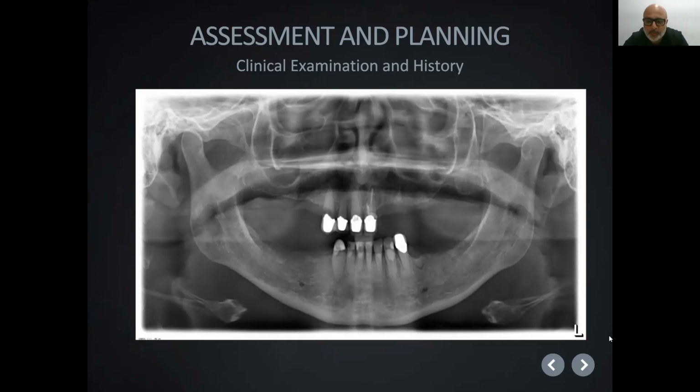Just going through it very quickly, you can see that with the teeth that are there, most of them have a poor prognosis. The lower teeth had a large number of restorations. You've got periapical lesions, heavily restored teeth, widening of the lamina dura, periodontal ligament changes, and caries on the upper, and pretty much the same thing, as well as a failed root canal treatment, lack of teeth, and bone resorption. There wasn't anything particular other than the position of the mental foramina, which were pretty much normal. The sinuses were slightly anterior, and there is some pneumatization, particularly on the patient's right.